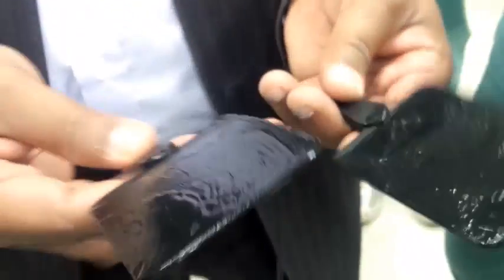Make sure you put adequate gel, not more or less. If you put, for example, gel like this, is this area good or not good? No, there is nothing, there is no gel in this area. So that is bad, because that means there is no conductor present. Make sure all your contact area is covered by gel approximately.